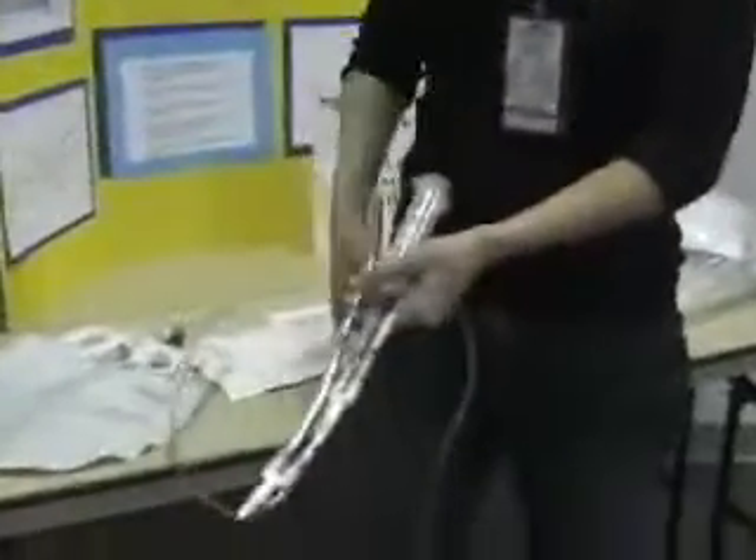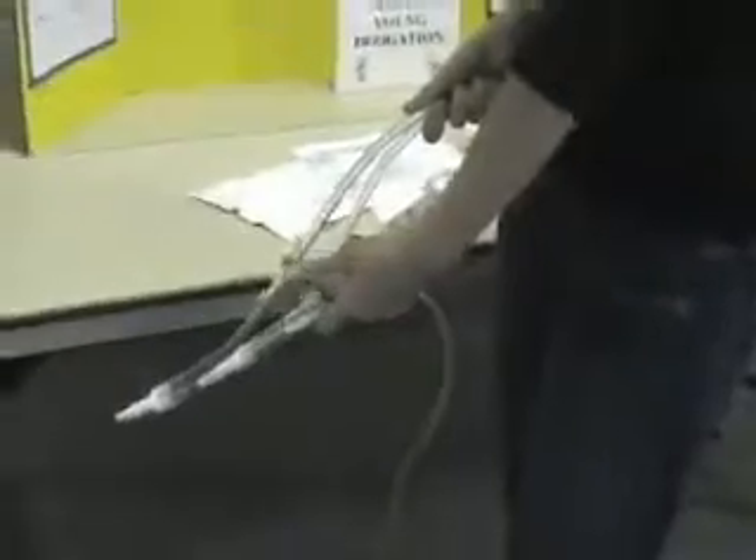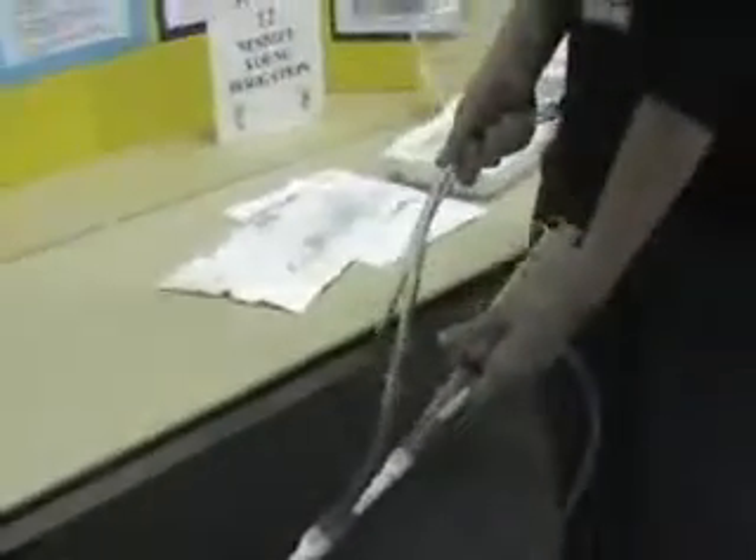To actually irrigate the bladder, you want to clamp the Foley catheter drainage bag nice and tight so it doesn't leak anything. This drainage bag will be down to the floor. You're going to hold it in your non-dominant hand — I'm right-handed, so I keep this part in my left hand — because you want to use your dominant hand to actually pump the bladder.